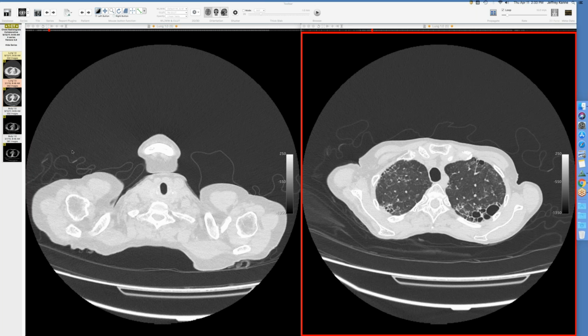I think we need to have a category of bubbly lung disease, and this case and other mysterious cases ought to be written up and published as bubbly lung disease. That is, at first blush, you're going to call it honeycombing, but it doesn't have the fibrotic component. So we've got to combine cases for this mystery.